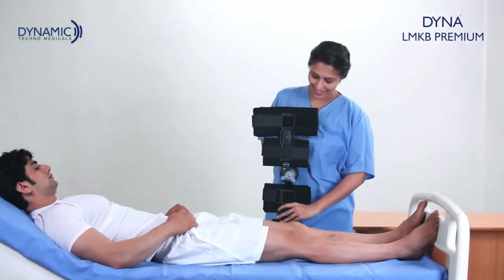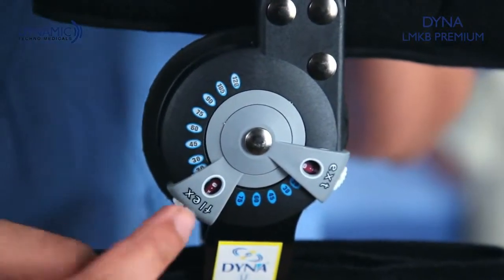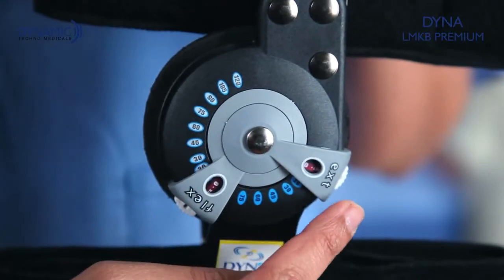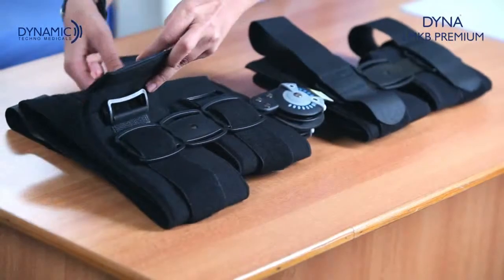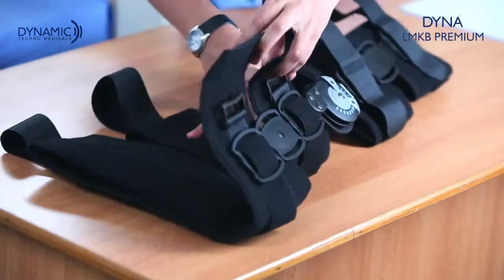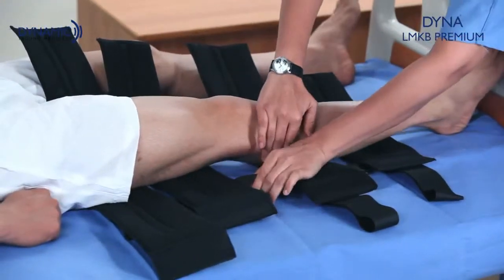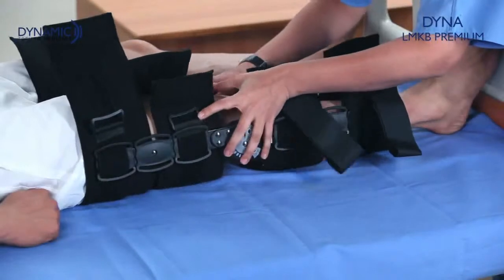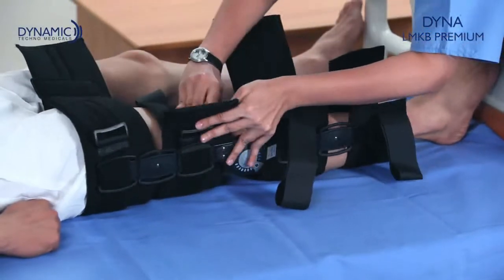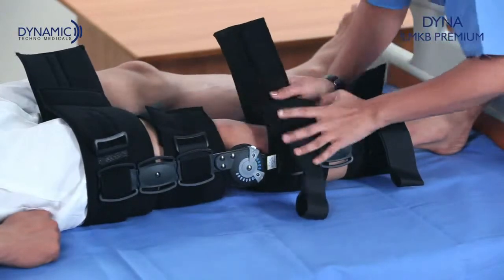The patient should be in a lying position. Set flexion and extension to zero degrees by pressing the flexion and extension buttons. Unfasten the Velcro bands and place them below the leg. Keep the flexion and extension setter on the center of the knee at the medial and lateral sides on both sides.